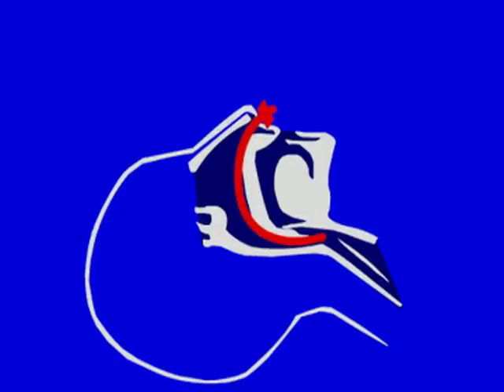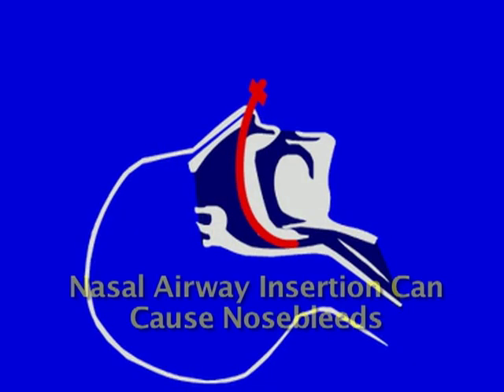A long nasal airway can stimulate the epiglottis. If coughing or gagging occurs, slowly withdraw the nasal airway a centimeter or two. Insertion of a nasal airway can cause a nosebleed. In the anticoagulated patient, use with caution or not at all.